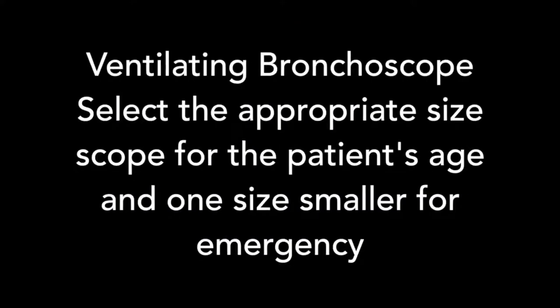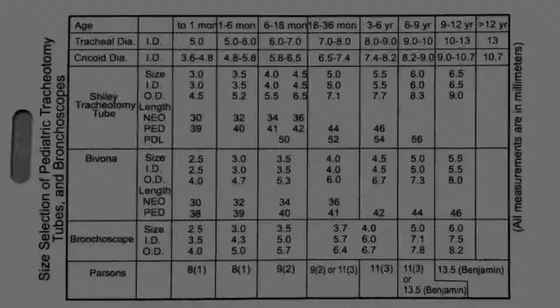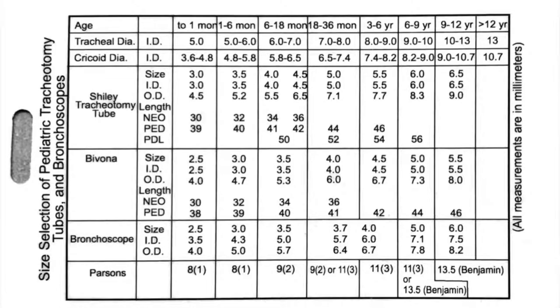On the Mayo stand, you will notice a ventilating bronchoscope. It is important to select the right size for the patient's age and one size smaller in case the airway is smaller than you anticipate for age.